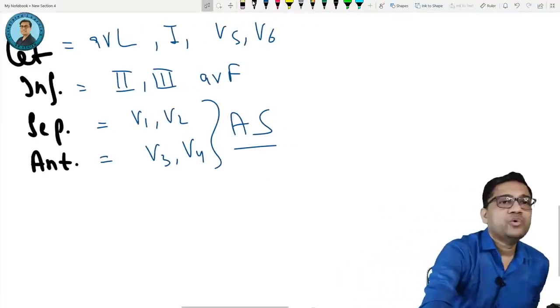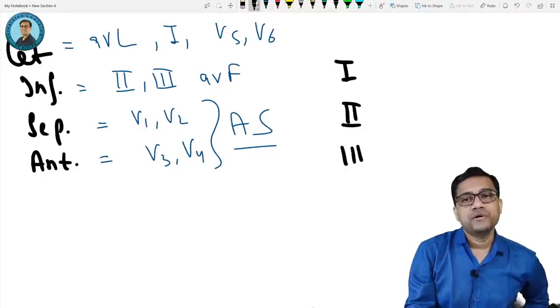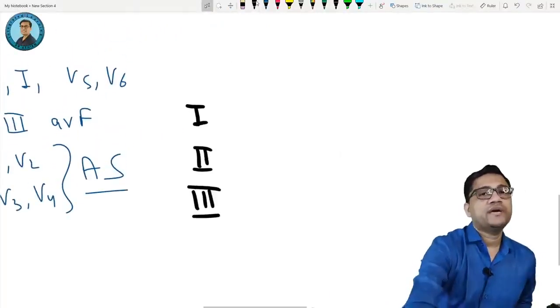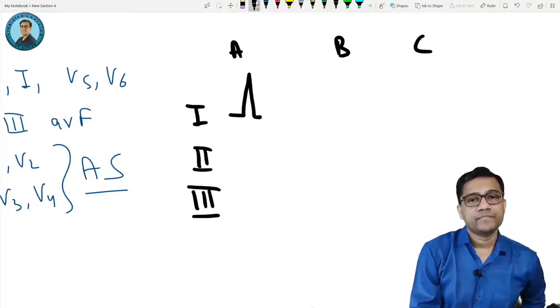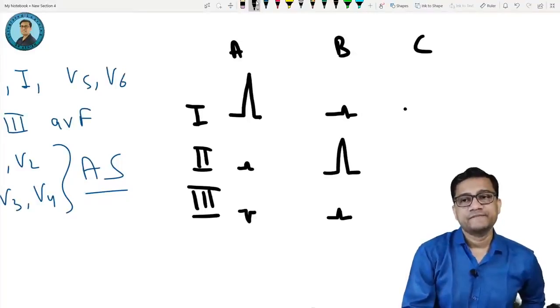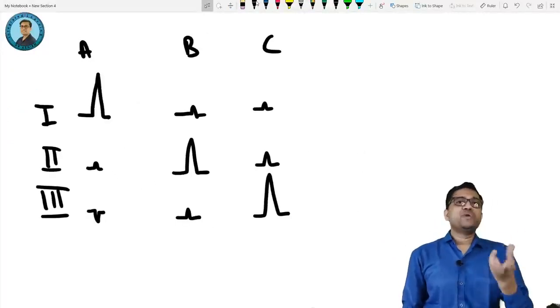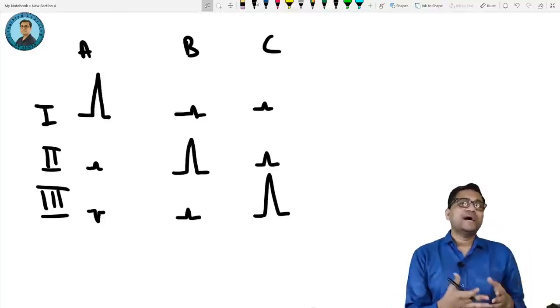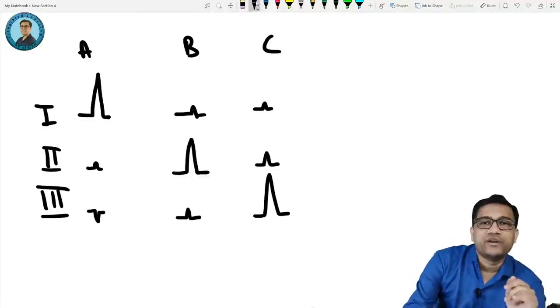Okay. Then how do you know the axis? Okay. How do you know the axis? Okay. I'll make you tell me. 1, 2, 3. I'm giving you some ECGs to solve. Okay. So this is patient A, B, C. Okay. Look at this. So diagnosis, ABC diagnosis. AVR is just looking at the cavity. It's an inverted lead. It's called the opposite lead. AVR ignore. Okay. So any minor doubt, leave it. Okay. Yes. All are right, inferior. Okay. So do the diagnosis of ABC.